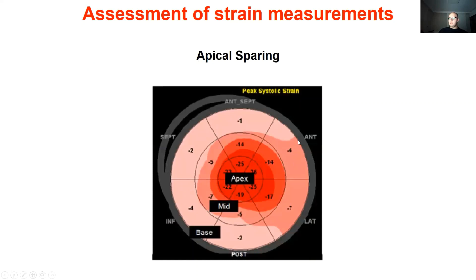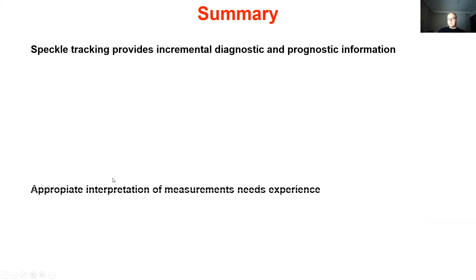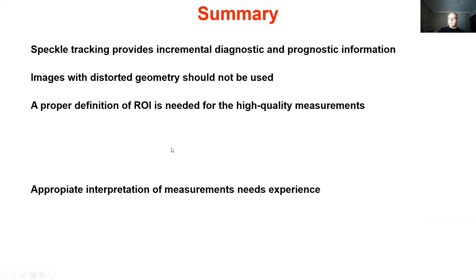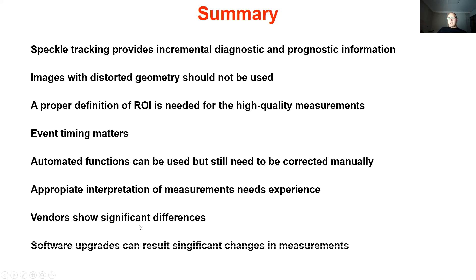Here is a case of amyloidosis with apical sparing, since deposits are mainly located in the basal segments. To conclude: speckle tracking provides incremental diagnostic and prognostic information. Appropriate interpretation of measurements requires experience. Images with distorted geometry should not be used. A proper definition of region of interest is needed for high-quality measurements. Event timing matters. Automated functions can be used but still need to be corrected manually. Vendors show significant differences, and software upgrades can result in significant changes in measurements. Thank you very much.